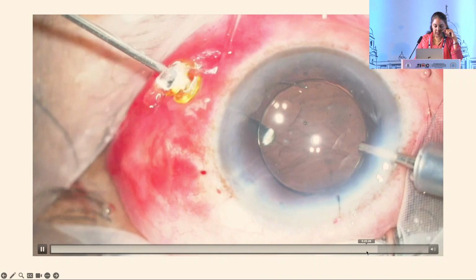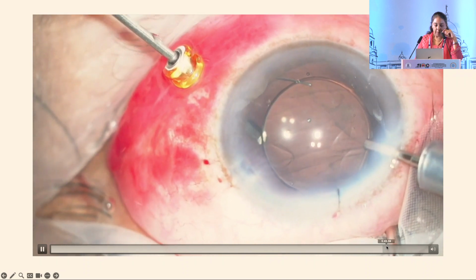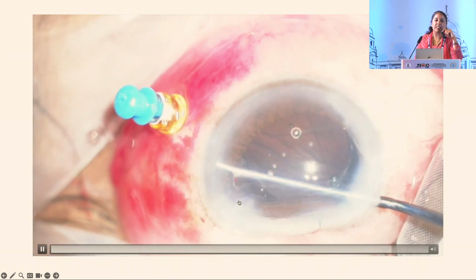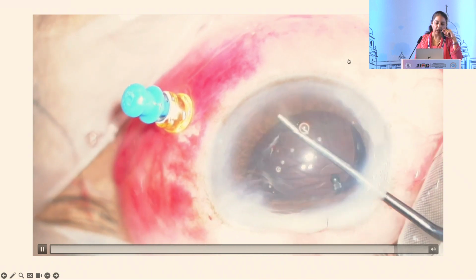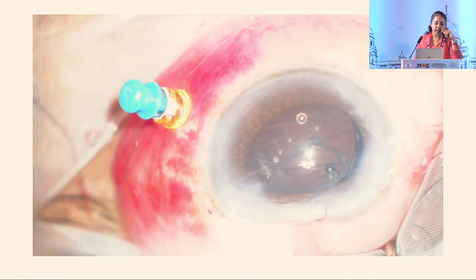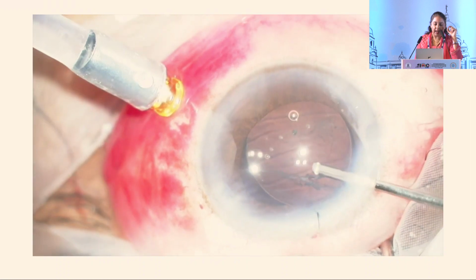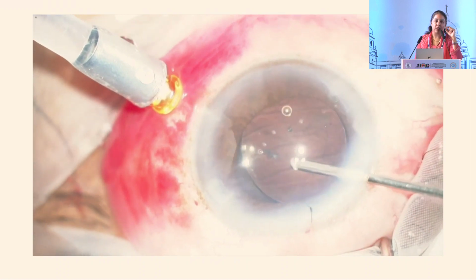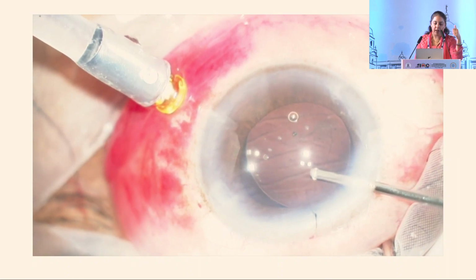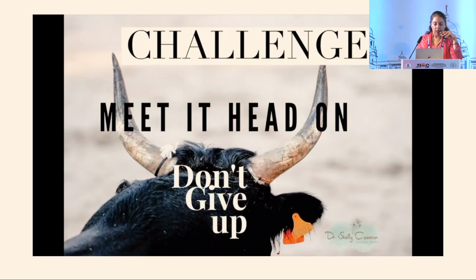This is the end of the surgery where we feel that we have cleared off as much vitreous as is there, but you see the triamcinolone is helping you detect little strands of vitreous that are actually incarcerated in the wound. So triamcinolone staining and visualizing vitreous in its entirety is very important intraoperatively and even at the end of surgery, so that you don't leave a patient with incarcerated vitreous or vitreous in the AC, because this increases your risk of corneal damage, glaucoma, CME, and post-op retinal problems.